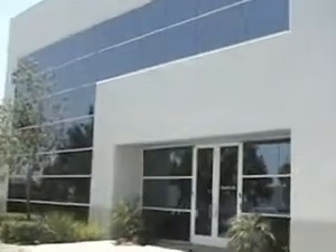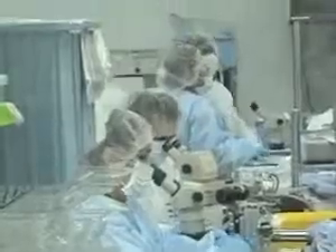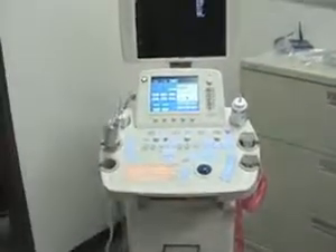This is Colin Stewart, Innovation Writer at the Orange County Register, taking you inside Senurex of Aliso Viejo for a demonstration of a new ultrasound breast cancer biopsy device that's awaiting approval from the FDA.